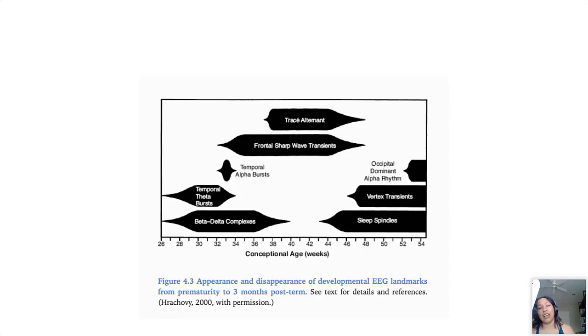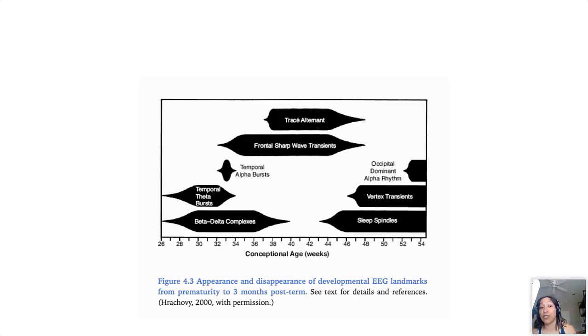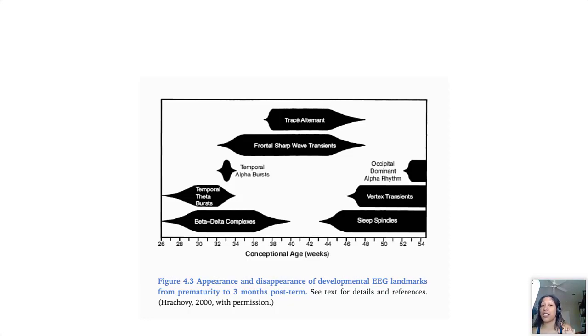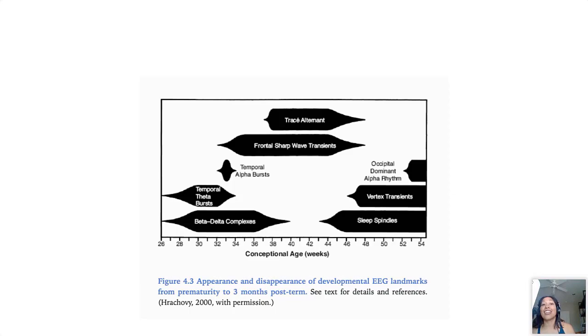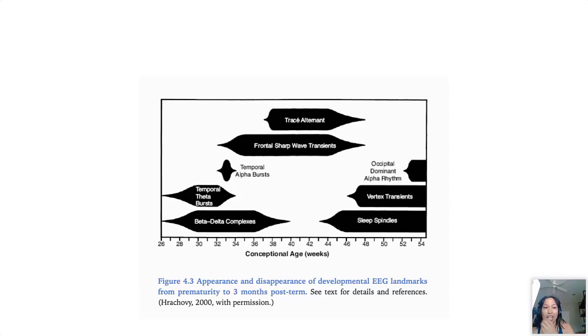Essentially with the young preemies and neonates at the bottom we see these beta-delta complexes which you can see mostly in preemies and all the way up to term. There are other grapho elements that don't quite last as long and can help us, as we call it, age-date the baby and kind of figure out how old would you expect the baby to be. And those are temporal theta range bursts that we see around 30 to 32 weeks, and then another feature that's even more specific in time are temporal alpha bursts that puts you pretty much at 33 weeks of gestation. So some of these are little helpful markers, a little helpful clues for us pediatric epileptologists. Then we see this very broad range of time for the frontal sharp wave transients, those encoches frontales that we saw earlier, looks like little check marks in the frontal regions. Those last a long time so those don't really help you in terms of figuring out what age the baby could be, but are there for a long range of time from like 32 weeks all the way to six to eight weeks of being alive.